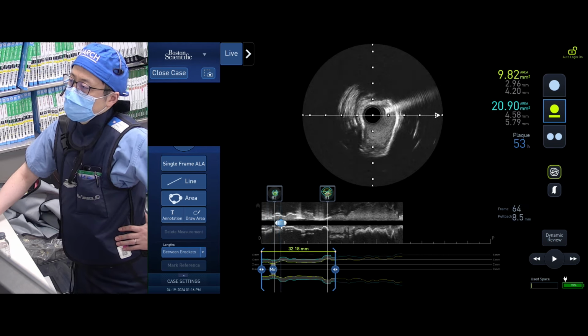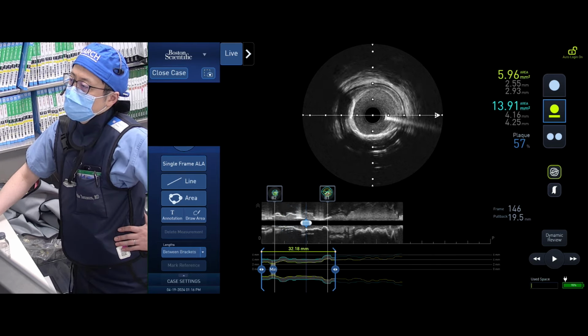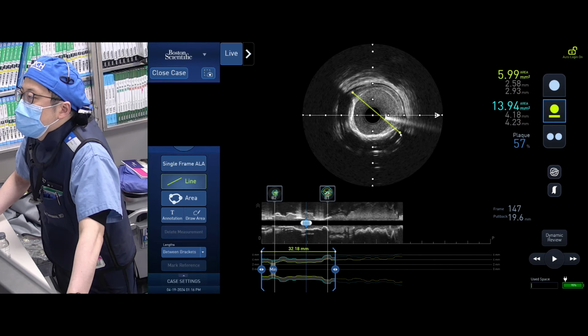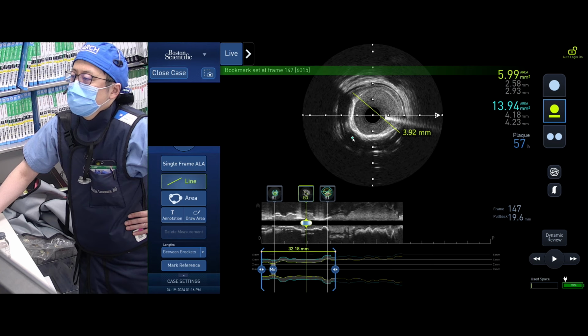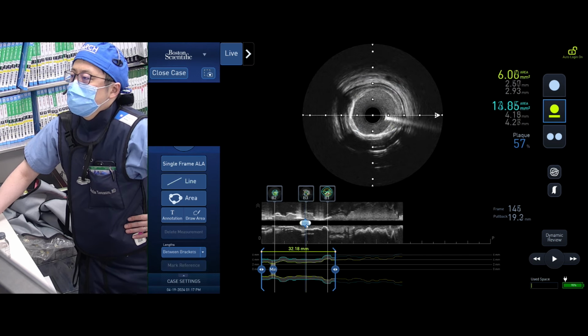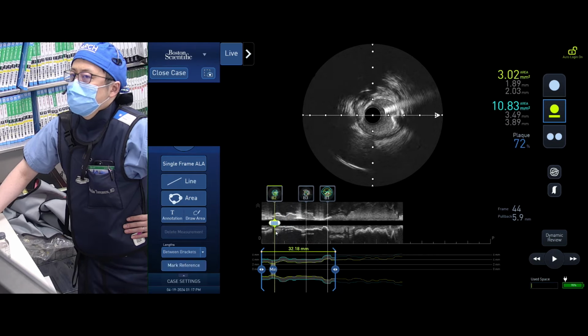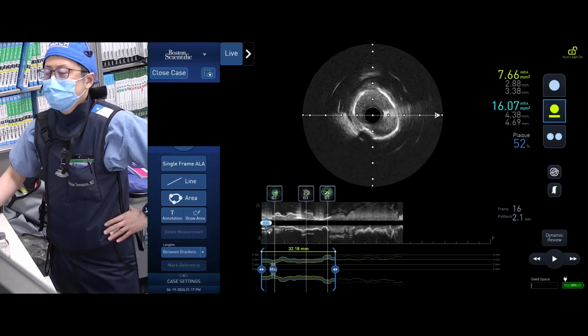But you can see, and whenever you do imaging here, you have to go into the branch to really assess the true ostium. You may sometimes overestimate that area when you pull back on IVUS. OCT can do 3D reconstruction, and you can actually just do the main branch and look at the diagonal per se. But with IVUS, you usually have to go back to that angio.